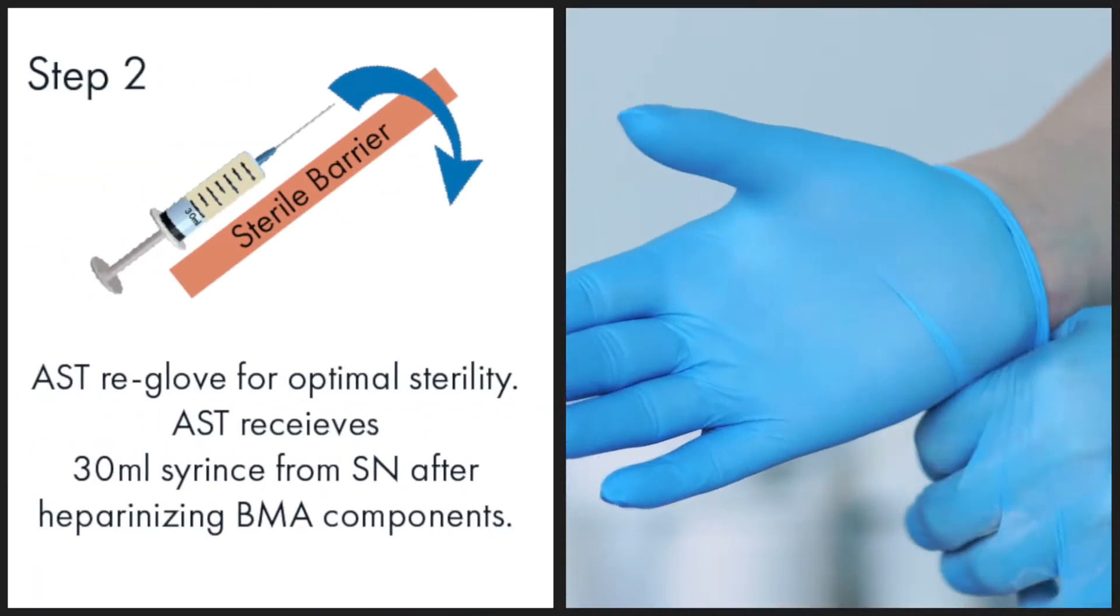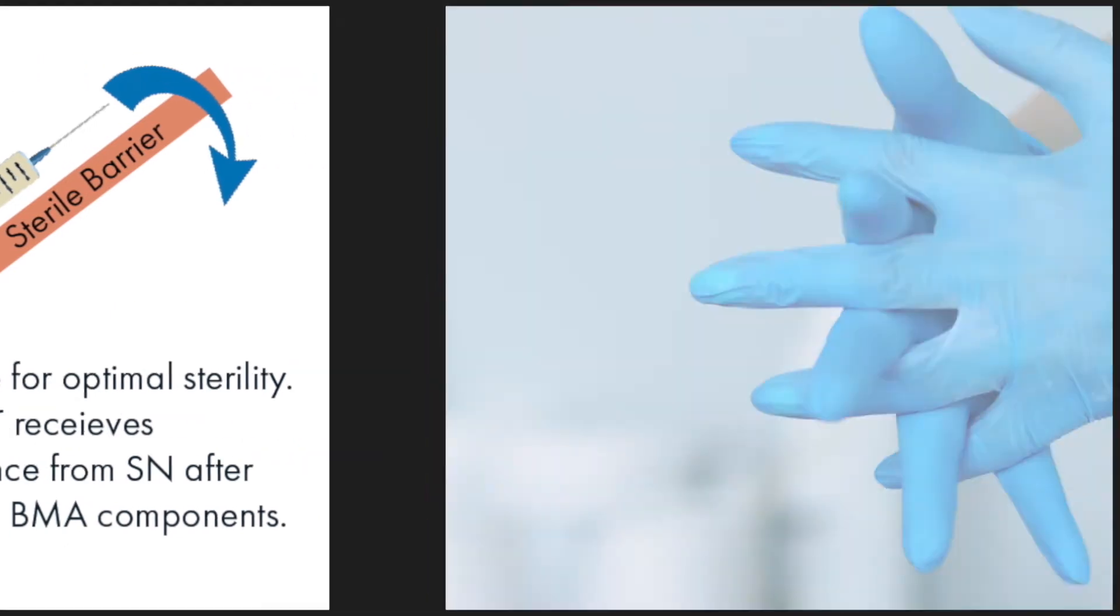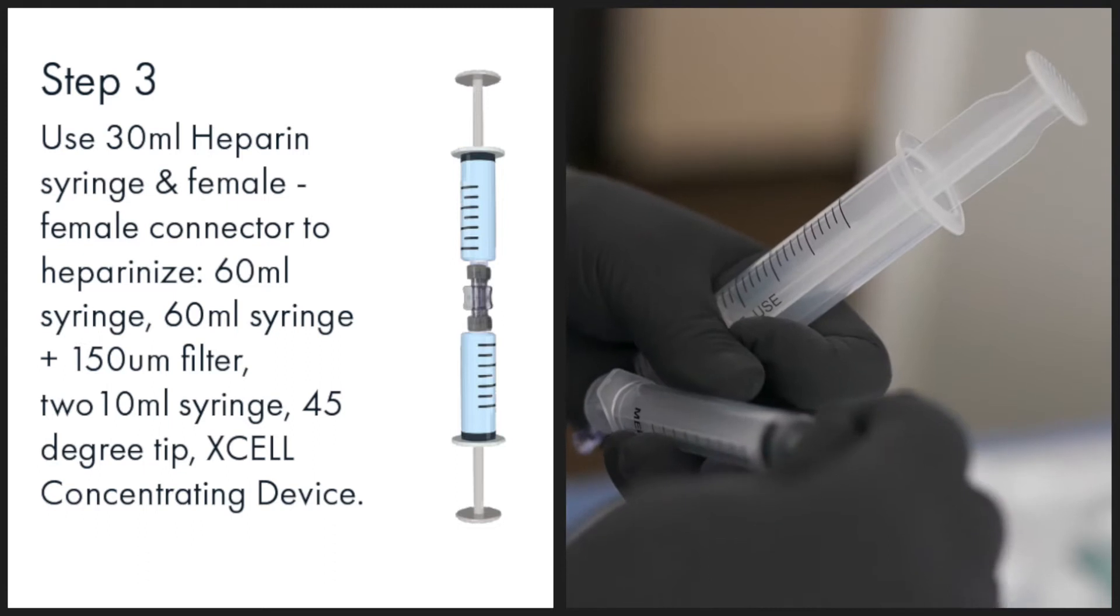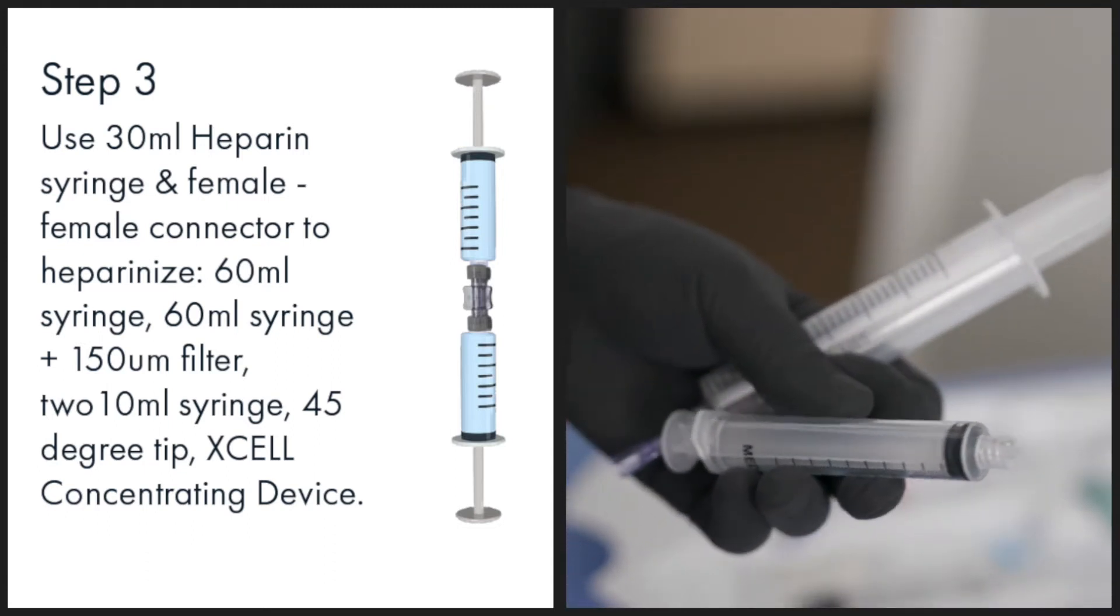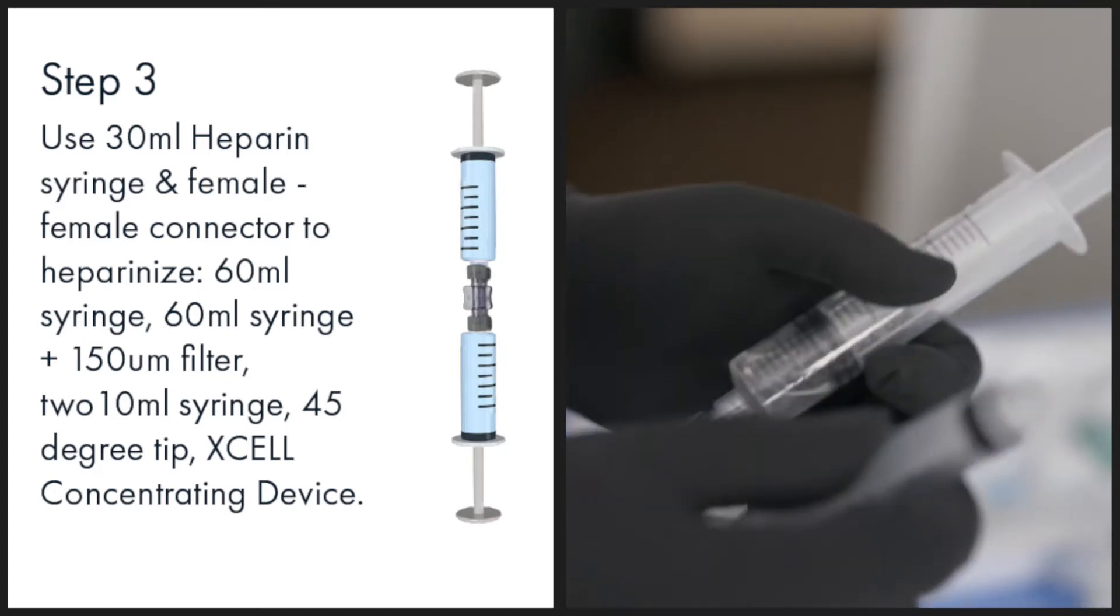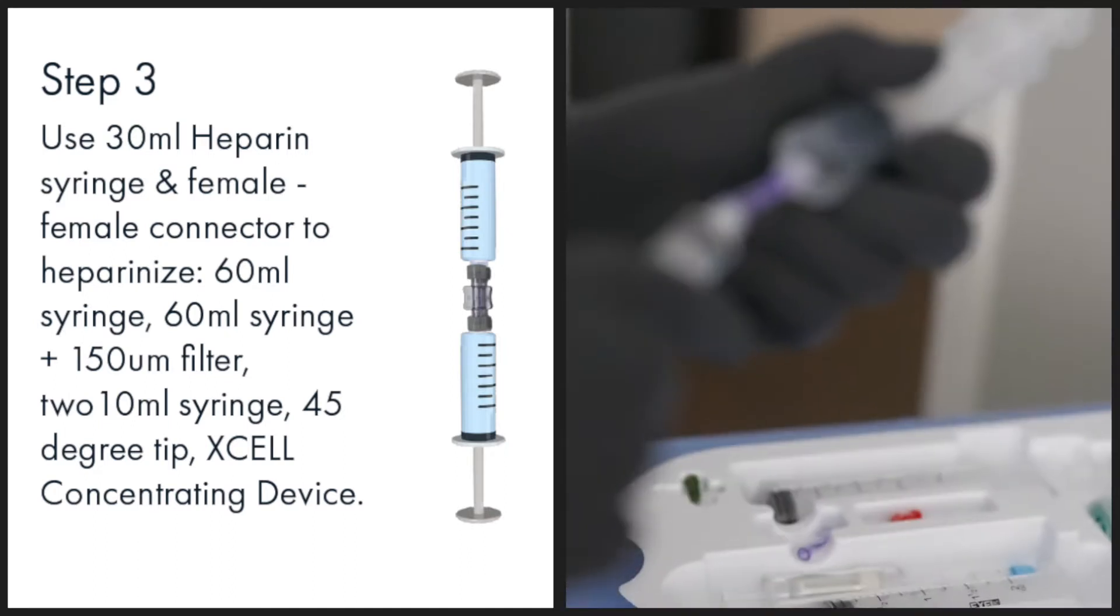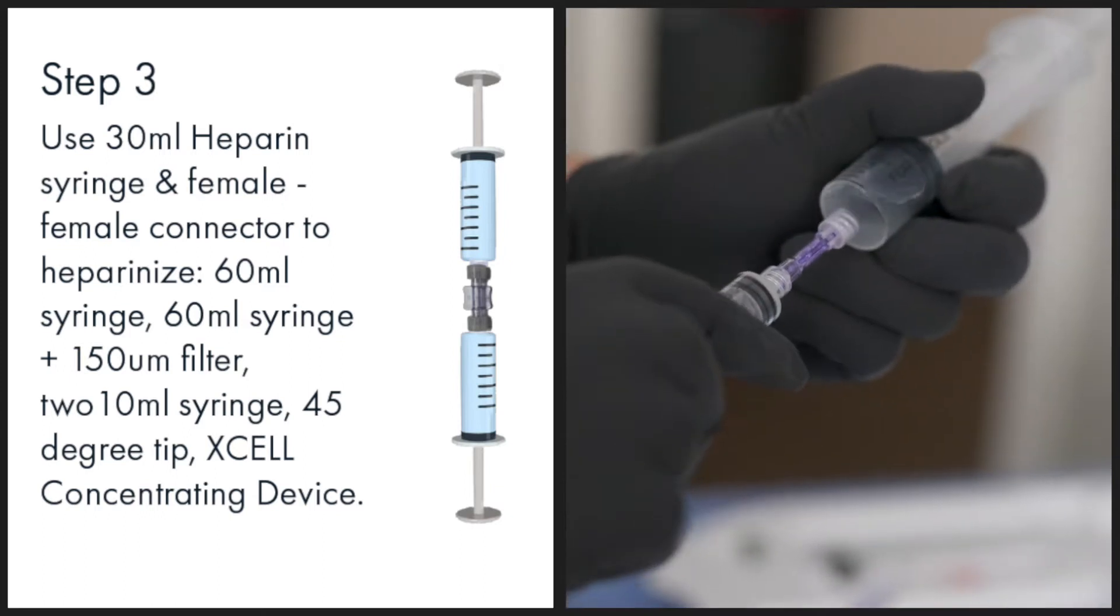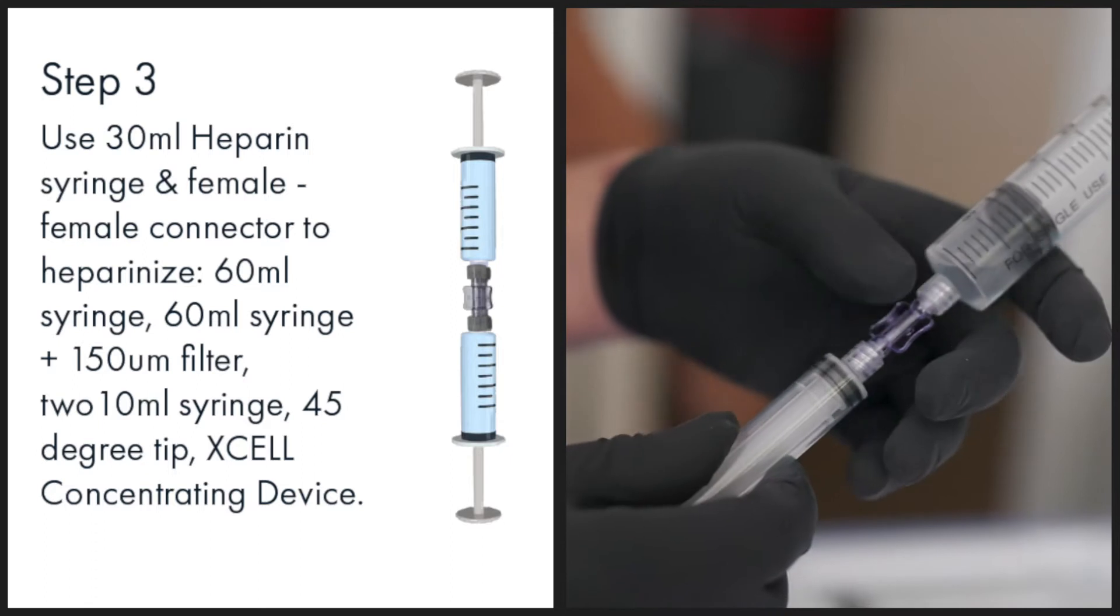Assistant receives 30 milliliter syringe from scrub nurse after heparinizing bone marrow aspirate components. The assistant will use the 30 milliliter heparin syringe and female to female connector to heparinize the 60 milliliter syringe, the 60 milliliter syringe with filter, two 10 milliliter syringes, the 45 degree dispensing tip, and the XL concentrating device.